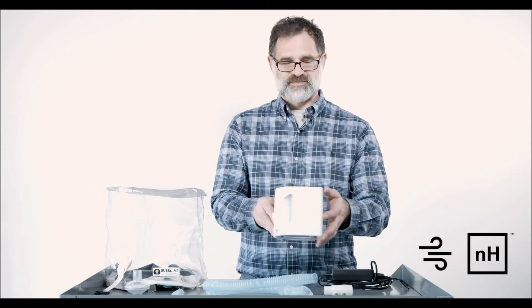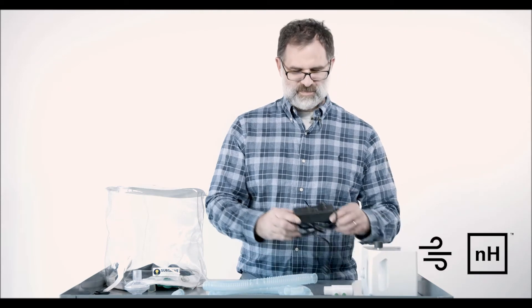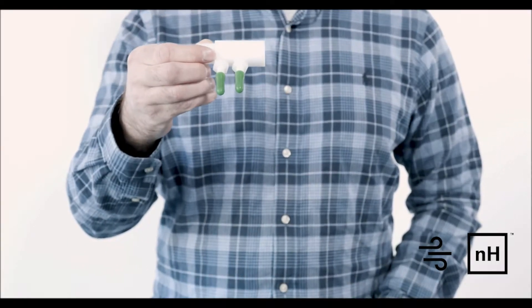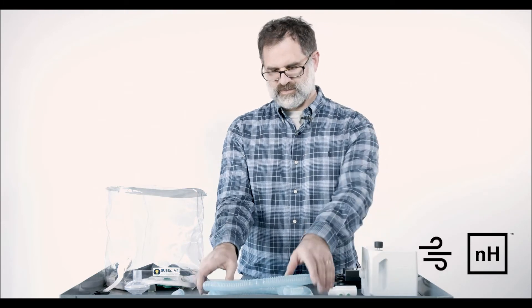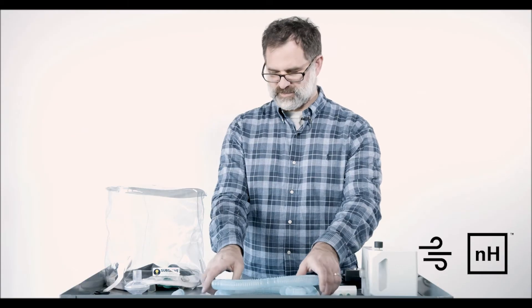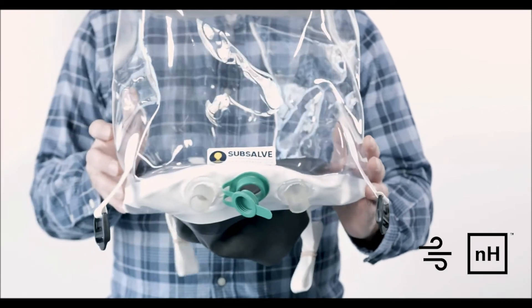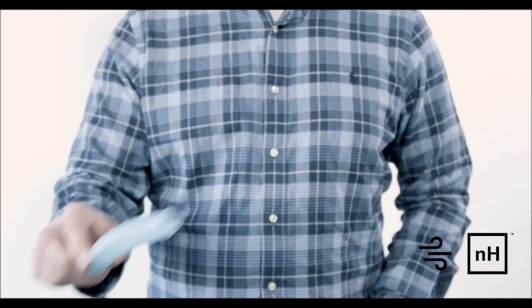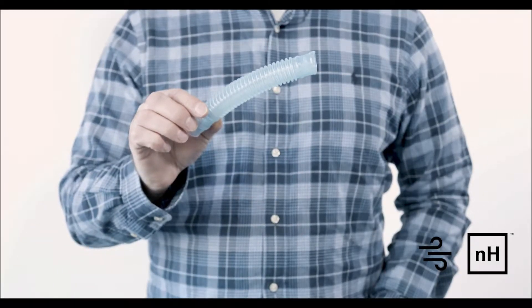The minimum required supplies are available as a kitted solution and include an nHale, a 15-volt power supply, a dual barb oxygen adapter, a 1.8-meter length section of corrugated tubing, a Subsalve oxygen treatment hood, a short 100 cc section of corrugated tubing, and a viral filter.